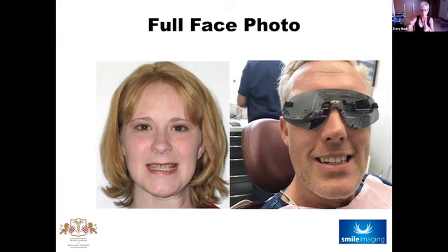And so when we present the imaged case to the patient, it's exactly the same really. Their eyes are taken away from their own teeth, and they're looking at what's going on in the glasses, the same as we are, rather than what's actually changed about their own teeth. So if you can, a nice clear background, get them to stand against the wall or something, and a nice headshot photo.